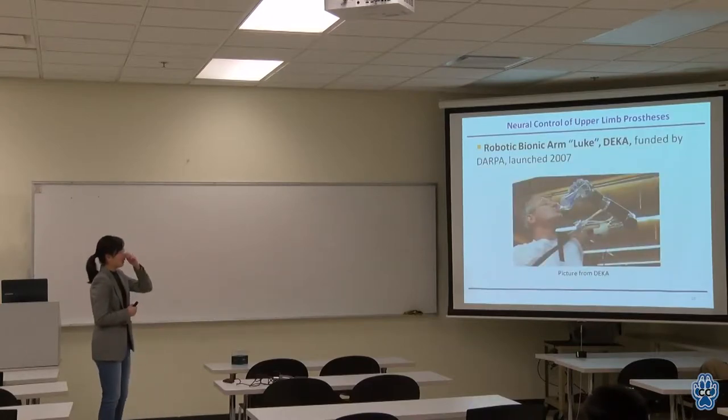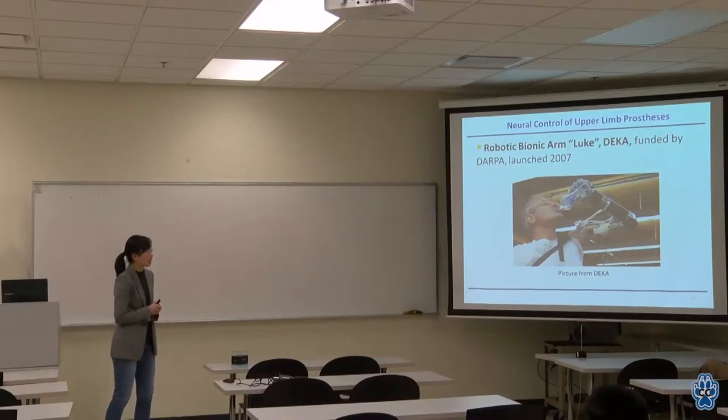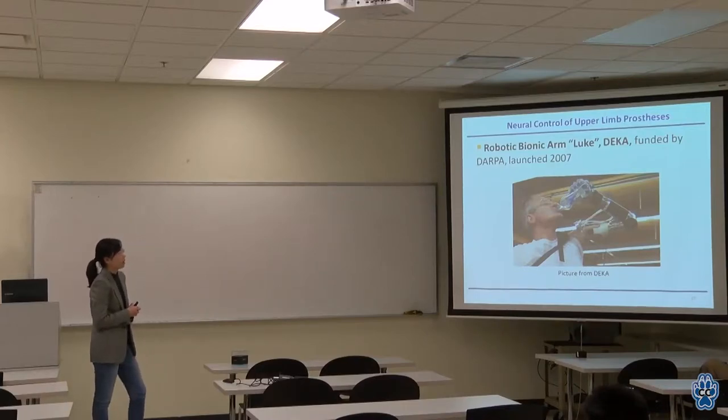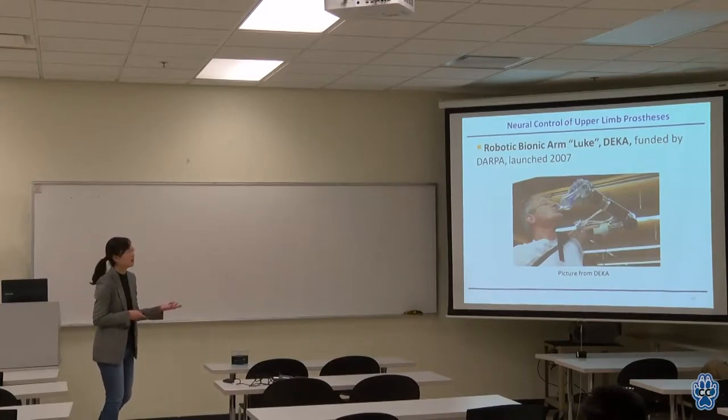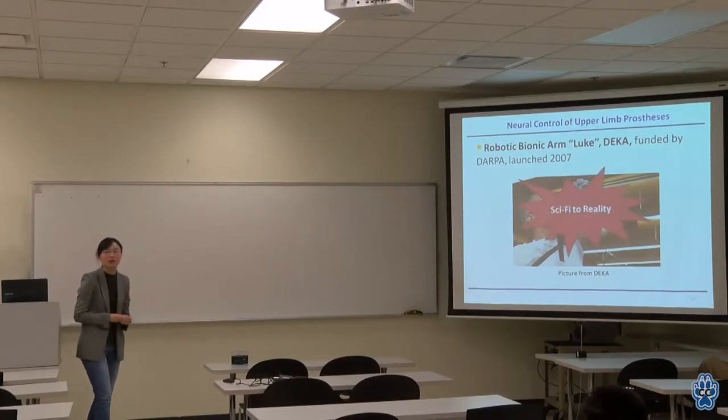Another project is developed by DEKA, funded by DARPA, with several research institutions involved. This project was launched in 2007, so it has been more than 10 years, and they have continuous progress. This project developed an EMG-controlled bionic arm for multi-degree-of-freedom control. What is interesting is that this arm is named Luke after Luke Skywalker in Star Wars, meaning that science fiction finally becomes reality.